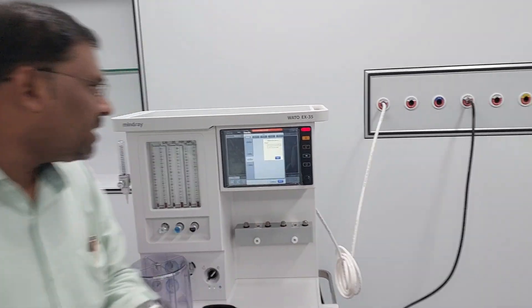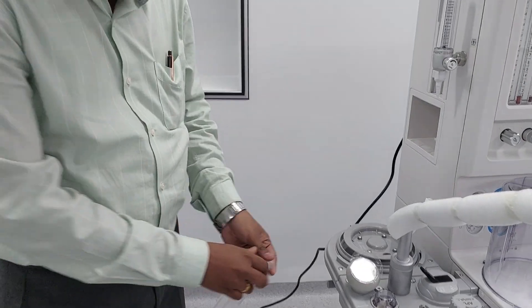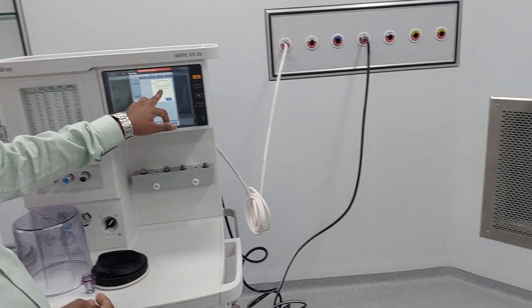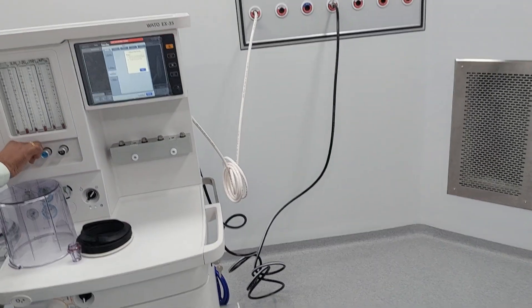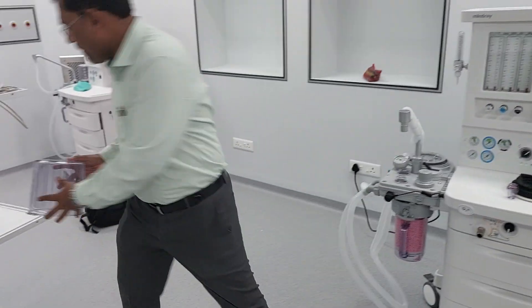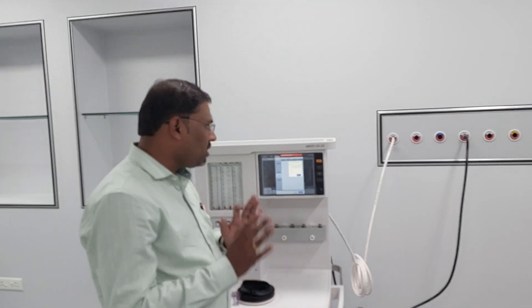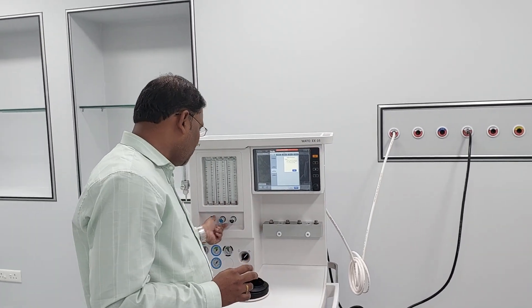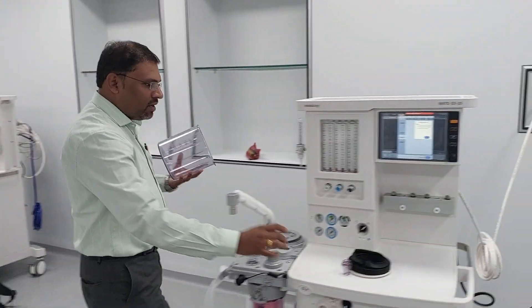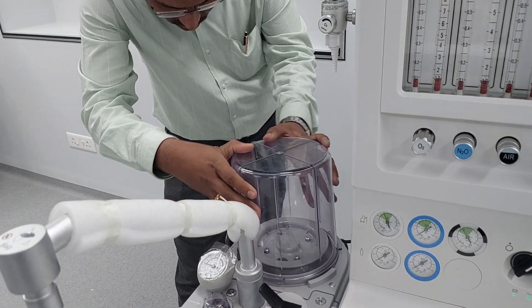Plug the Y-piece into the leak test port. This is the Y-piece. Block the leak, then turn off all the fresh gas — in this way. Already we have plugged the Y-piece, turned off all the fresh gases. After removing this, close the bellow cover.